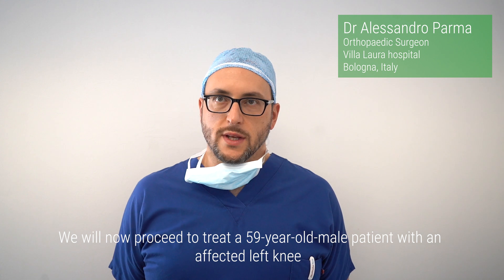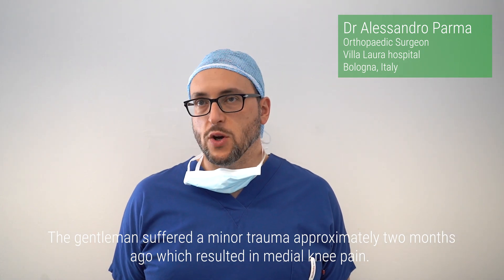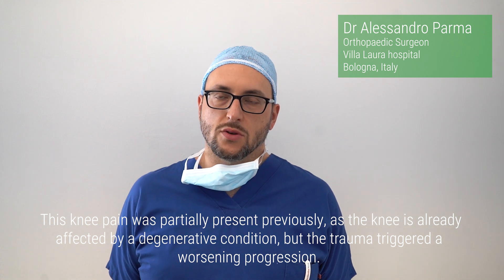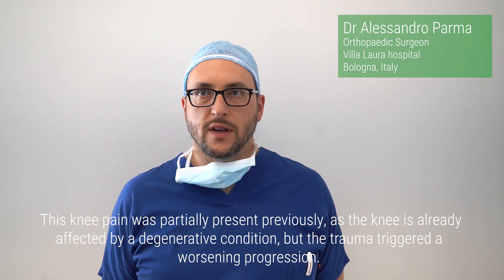We will now proceed to treat a 59-year-old male patient with an affected left knee. The gentleman suffered a minor trauma approximately two months ago, which resulted in medial knee pain. Knee pain was partially present previously, as the knee is already affected by a degenerative condition, but the trauma triggered a worsening progression.